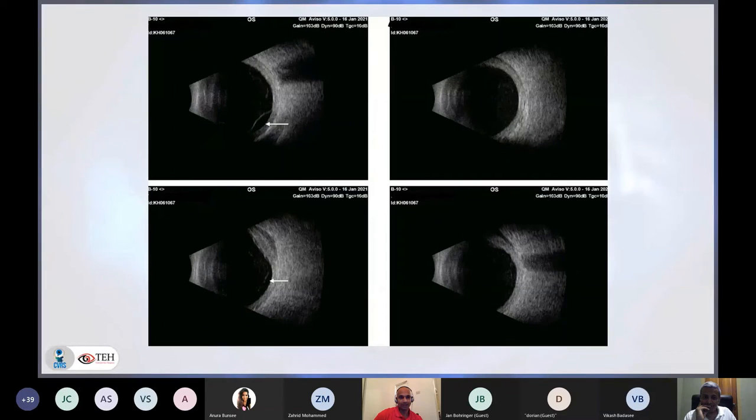So you really want to look at it. And this photo shows it a bit, but the subretinal fluid is actually affecting your ability to look at the internal reflectivity of the lesion itself and the height generated by the lesion. The interesting thing about the B scan is it shows a sort of homogeneous high internal reflectivity of the entire sclera wall. So correct. That is not in keeping at all with melanomas and secondaries. So I think you were well within the diagnostic right to say this is an inflammatory lesion of the sclera, and that's a nodule within that realm, and use a trial of steroids. And it seemed to be obviously the right diagnosis, and it worked extremely well.